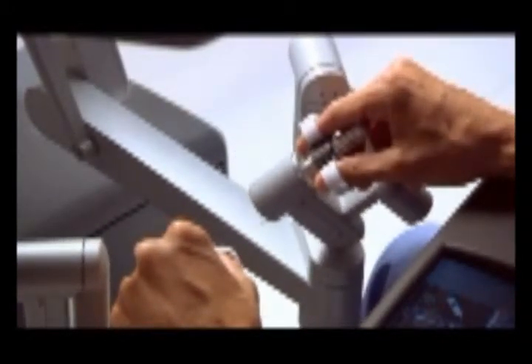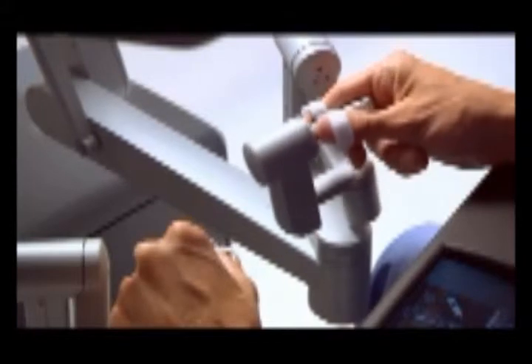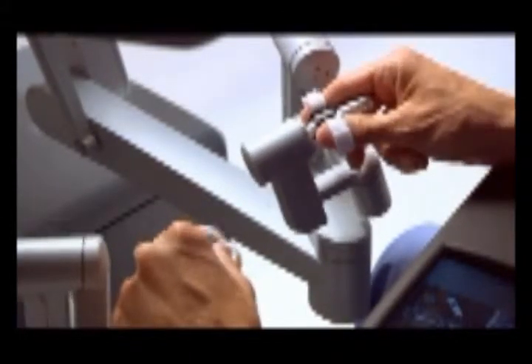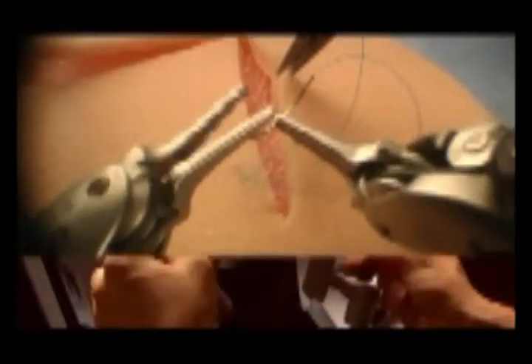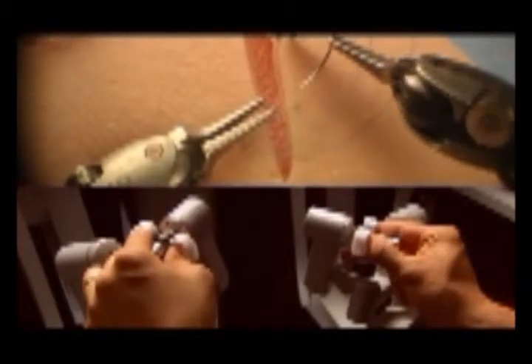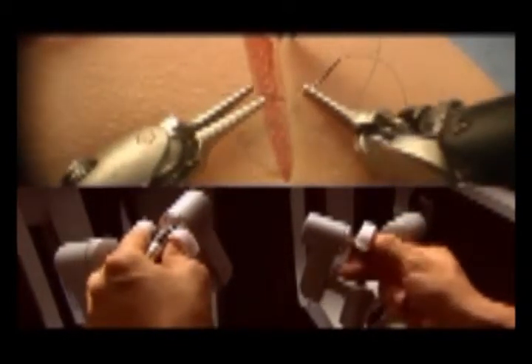Powered by state-of-the-art robotic and computer technology, the surgeon's hand movements are scaled, filtered, and seamlessly translated into precise movements of the endo-wrist instruments. The net result is an intuitive interface enabling unparalleled precision, dexterity, and control.